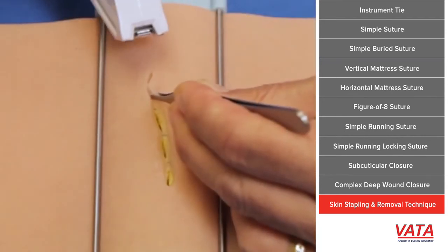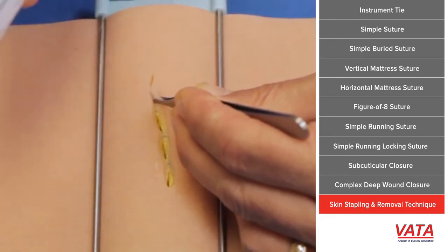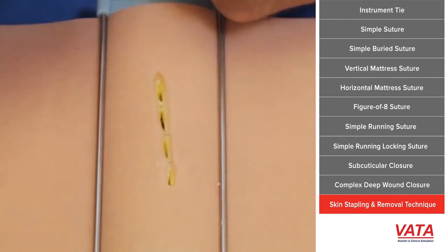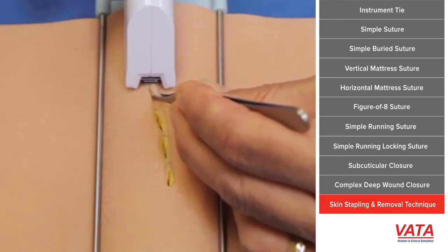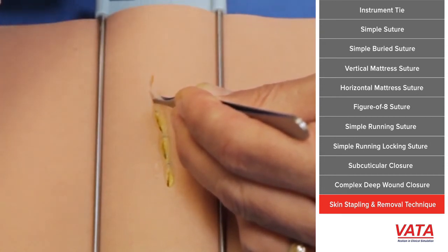So you approximate them. There's a line in the middle of the stapler, sa gitna ng stapler. That should correspond to the suture line, to the wound line. Naka-tapat siya doon. And yung staple.